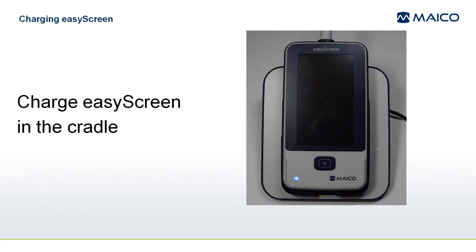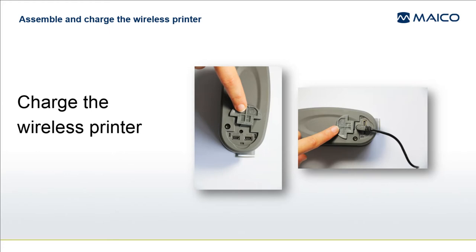It can take several hours to fully charge the EasyScreen depending on its initial charge level. If your system includes the wireless printer, you will need to insert the rechargeable battery, secured in place with the cover and screw, and charge it fully prior to use.